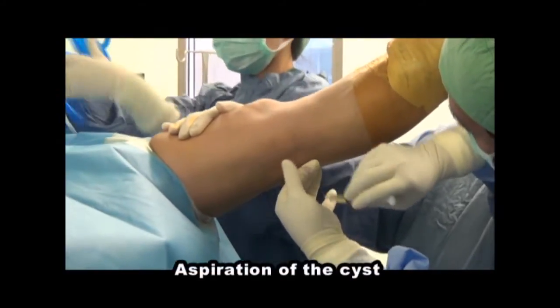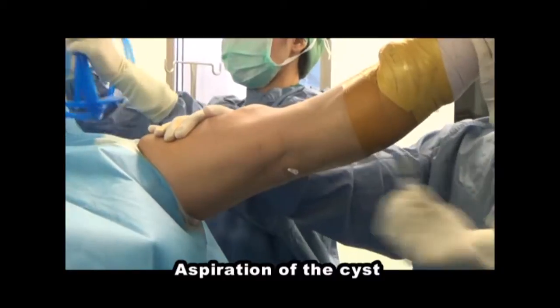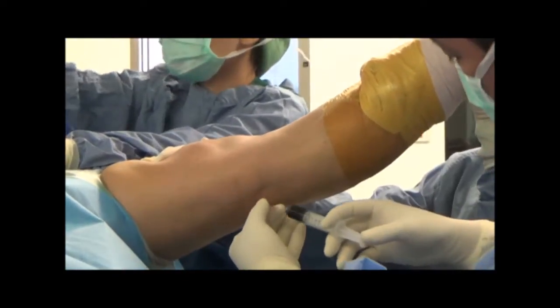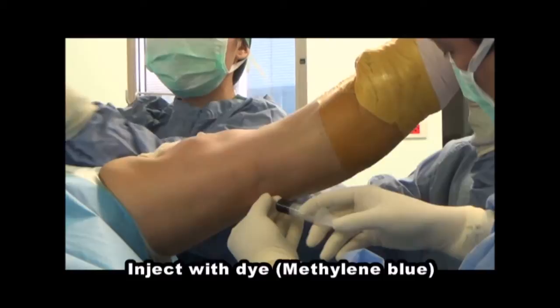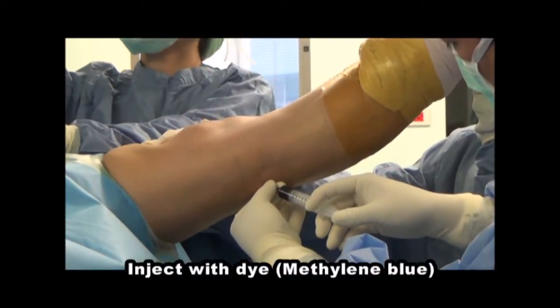After spinal anesthesia was performed, we start with the aspiration of the cyst, then injection of the methylene blue dye into the cyst was done.